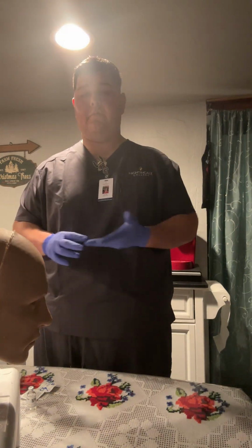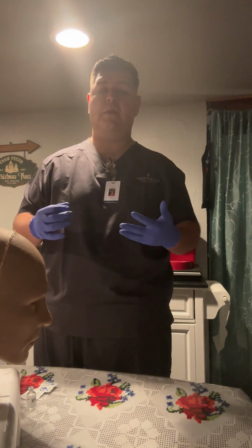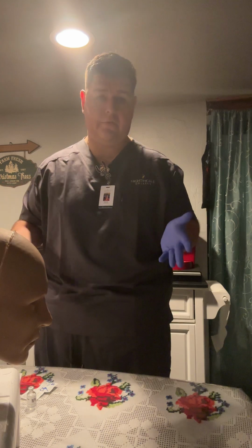So I just want to reiterate, my patient will be receiving 4 units of insulin and then 8 units of intermediate NPH insulin, which makes it a total of 12 units of insulin altogether.